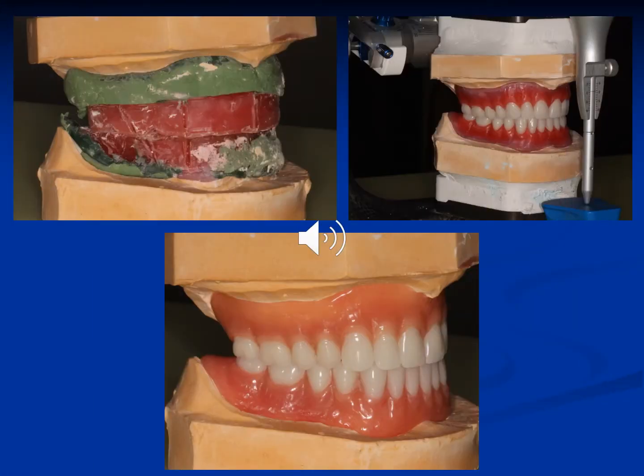Here, as you can see in the upper left segment, the maxilla, this is a case for a real patient. The maxillomandibular relation was recorded using the upper and the lower bite blocks. Then, according to this relation, the upper and the lower models were mounted on the articulator, and after that, the bite blocks were replaced with artificial teeth. So we did teeth setting, and after trying inside the patient's mouth and verifying that the artificial teeth were set properly and accepted, the dentures were finalized and constructed. Of course, all through these steps the articulators were used to adjust the teeth and set them according to the maxillomandibular relation that was recorded inside the patient's mouth.